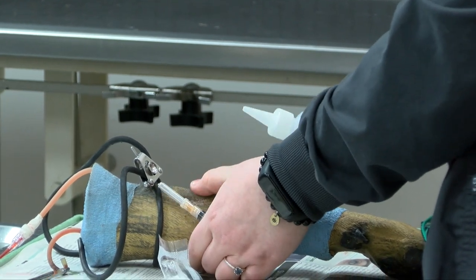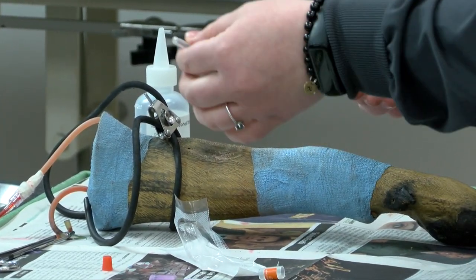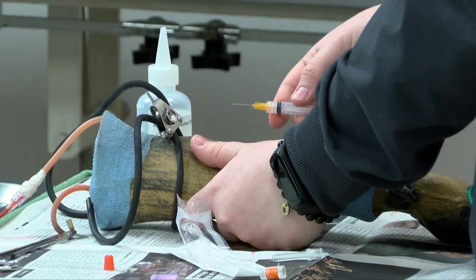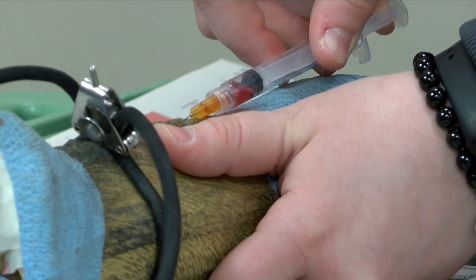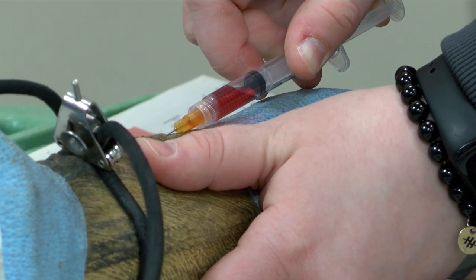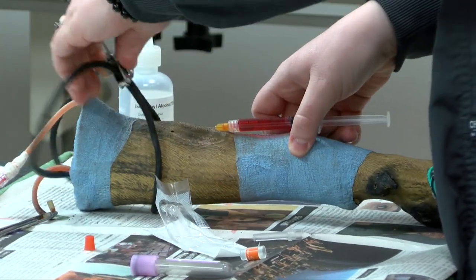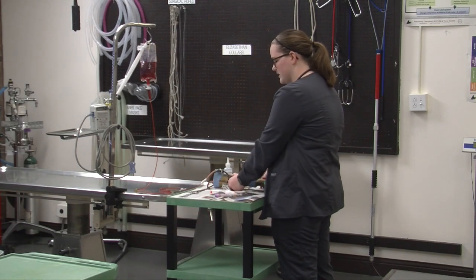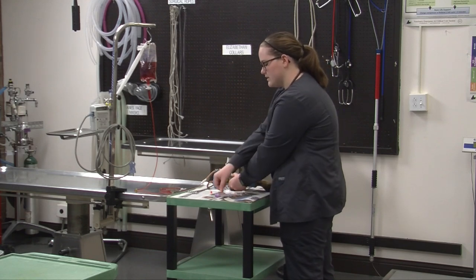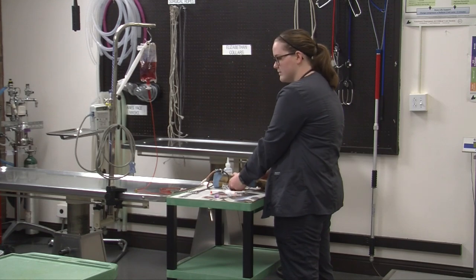Next I'm going to use alcohol to prepare the area. This does three things: it wets down the hair on the leg, makes the vein stand up, and cleans off the area of any debris. I'm going to remove the cap from my needle, then insert it into the vein at an angle. As soon as it's in I'll flatten it out and start aspirating with my syringe. It'll depend on how much blood is needed for whichever blood test is being done. Once I have as much as I need, I will release the tourniquet, hold my thumb over the area before I remove my needle, pull it out, and hold off the area so that it doesn't bleed or bruise. I would have an assistant transfer the blood from the syringe into this blood collection tube, which will store the blood until it is ready to go into a blood machine to be tested.